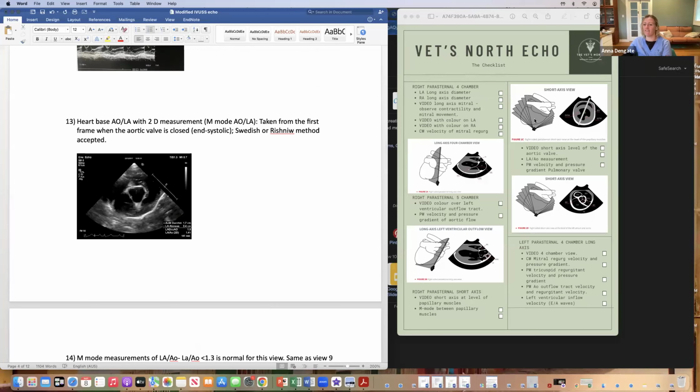Okay. So we're going to now fan up. We've been moving up through the ventricle, up through the mitral valve, and then just high of the mitral valve, we're going to stumble across this structure here called the aorta. And we're going to see a beautiful peace sign where the three valves are meeting up. In theory. In reality, it's actually really hard to get it really round, isn't it? Does anybody struggle with that? Yeah. And I'm always saying anti-clockwise, clockwise, anti-clockwise, clockwise when I'm teaching people to do this.